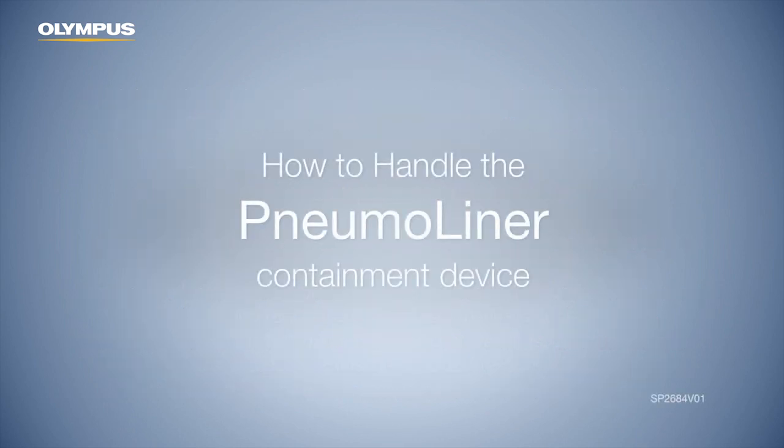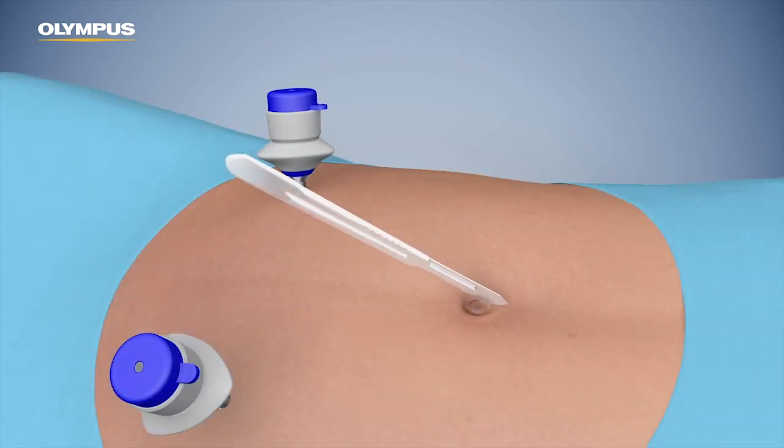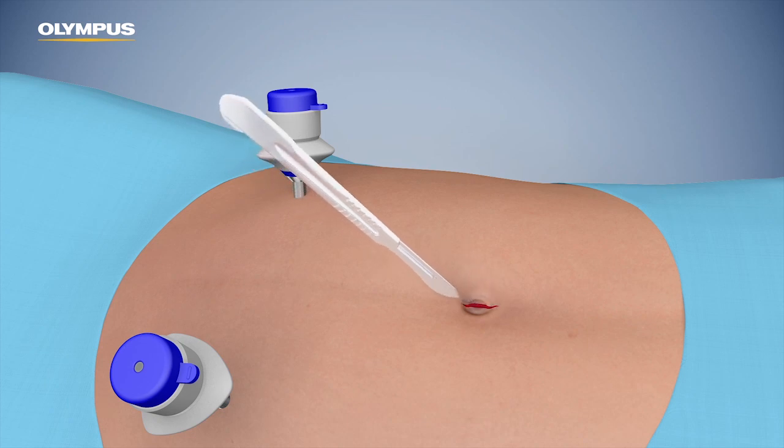This video demonstrates how to handle the pneumo liner containment device for morcellation with a laparoscopic instrument port. First, create an incision 20 to 25 millimeters long.